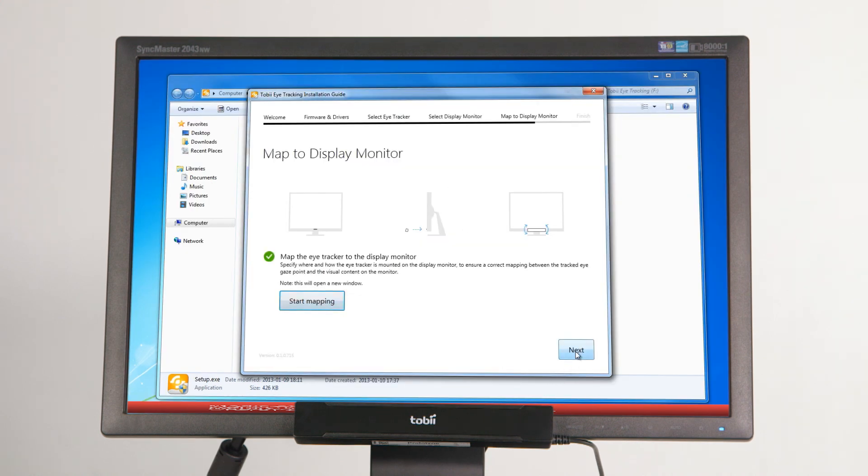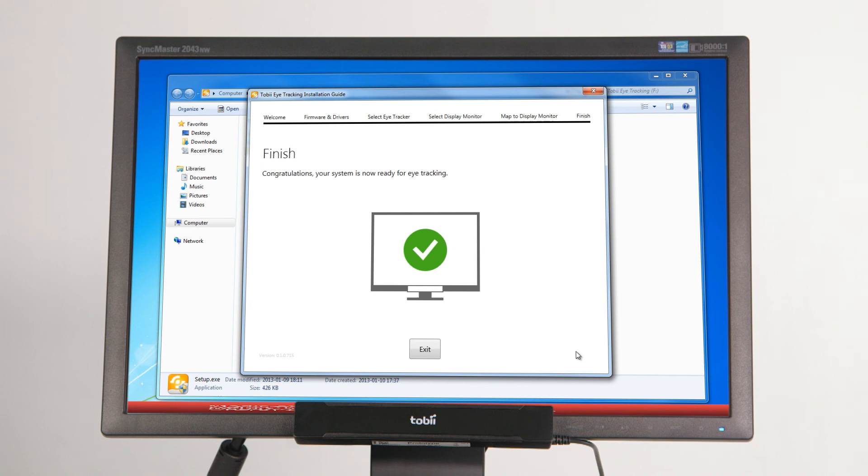Then press the Next button to proceed to the final step of the configuration. You are now done with the installation and configuration of the eye tracker. Your Tobii X2 eye tracker is now ready for use.